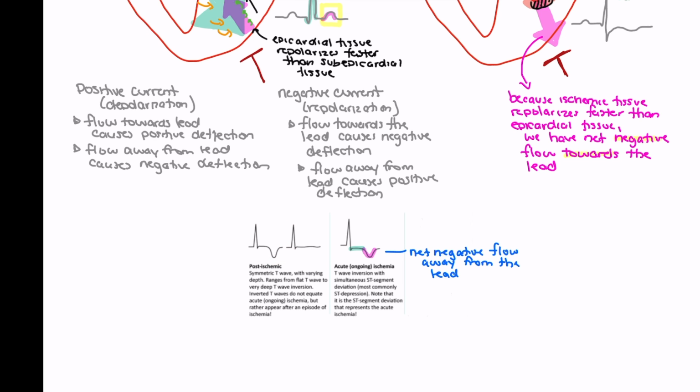That being said, there are lots of different causes of T-wave inversion, and we have to keep that in mind. One thing that we should be aware of is if someone's presenting clinically with symptoms of cardiac ischemia, and we see both ST depression and T-wave inversion, then it can increase our index of suspicion of cardiac ischemia for that patient.